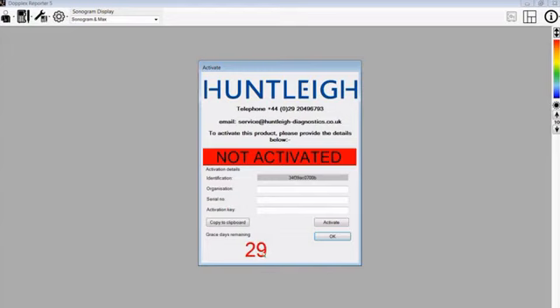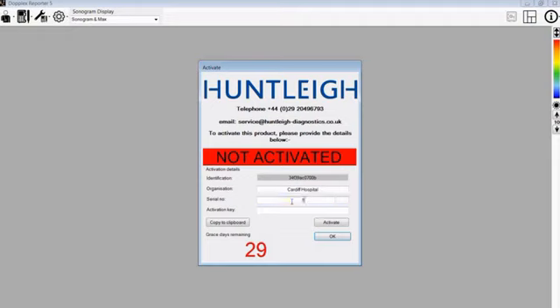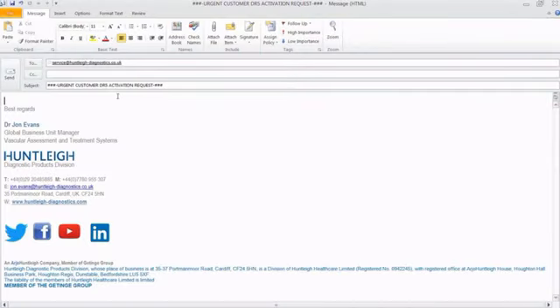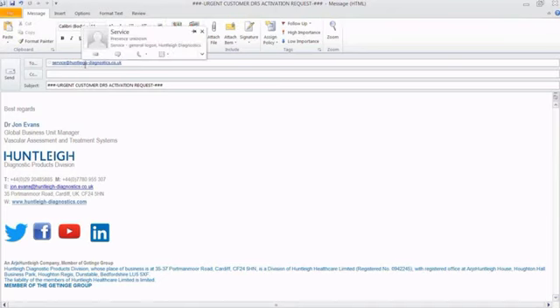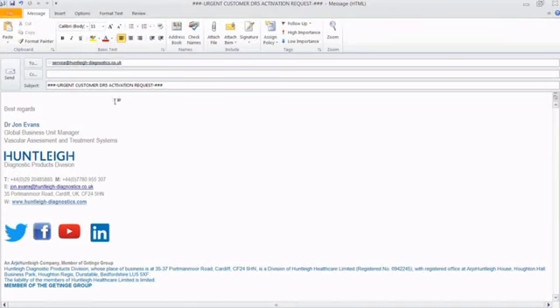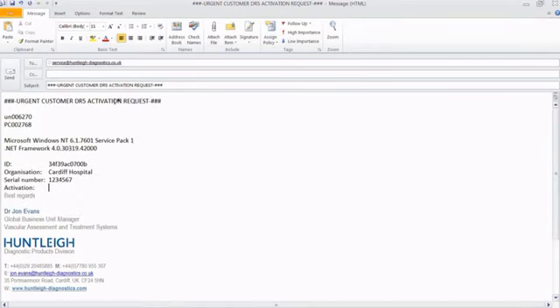The software will allow you up to 30 days of usage before activation is required. To apply for an activation code, complete the organisation box, and then enter the serial number which is shown on your license agreement. Then copy to clipboard and paste this into Outlook or your email package, and send this to service at huntleydiagnostics.co.uk.